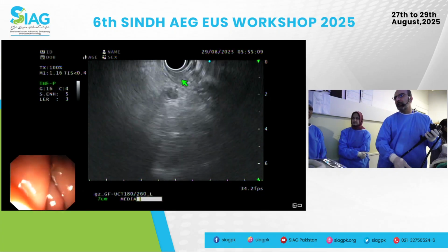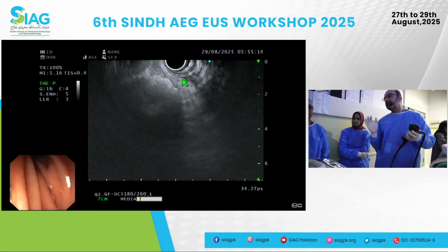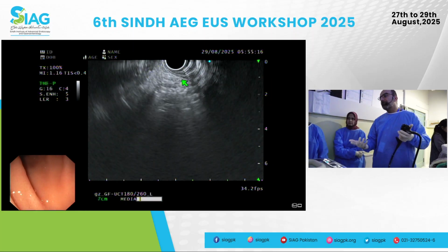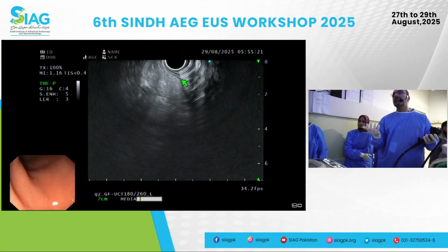I would also consider going into the head of the pancreas. Typically, if I have a good area, especially in the neck, I may just stick to that. Otherwise, I may switch my location and go to the head. Obviously, if you have a mass-like lesion, then you go for that area.